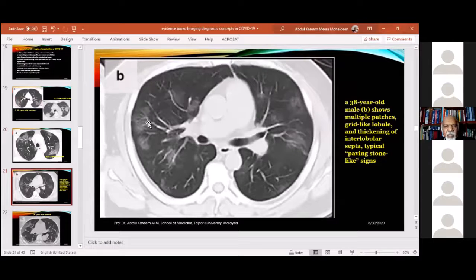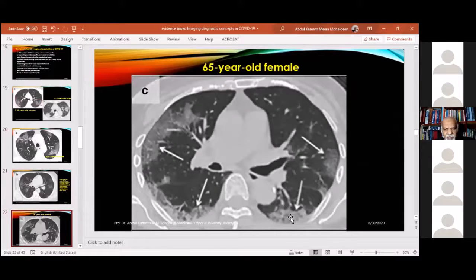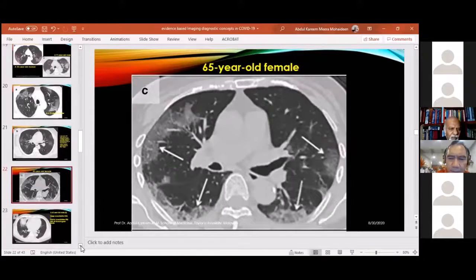Here you can see multiple lobulated areas in both sides of the lung. So you can see increased bronchovascular markings. The vessels are very prominent here. You can easily note all these findings. Here you can see likewise increased bronchovascular markings and also these fluffy densities, ground glass appearance.